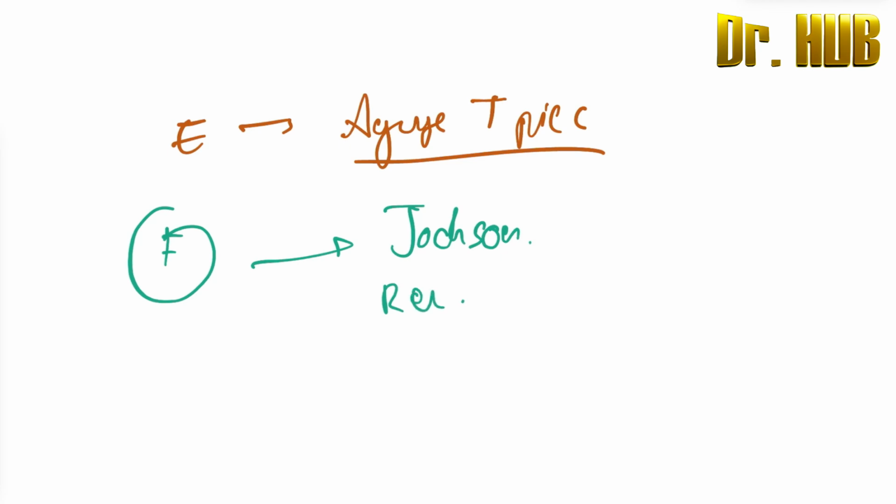So it is a Jackson-Rees, and F is nothing but a modification for pediatric patients. This is for the pediatric patients. So in the F, what we saw is there is a corrugated tube, there is a patient, and towards the patient end and the corrugated tube, there is presence of the FGF. And here the APL is absent. There is no APL valve.